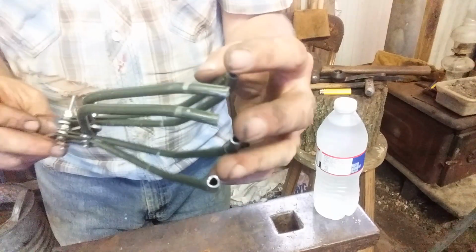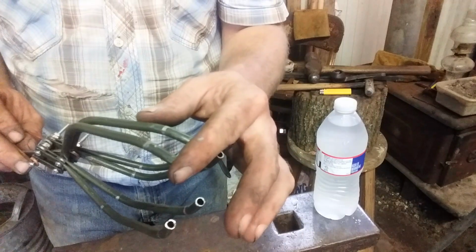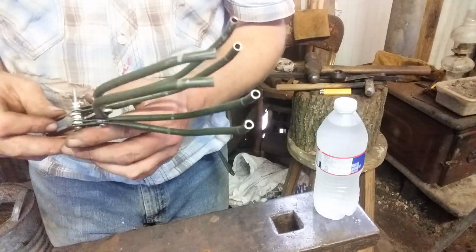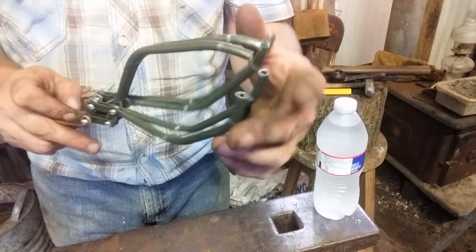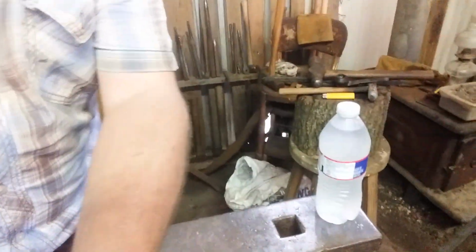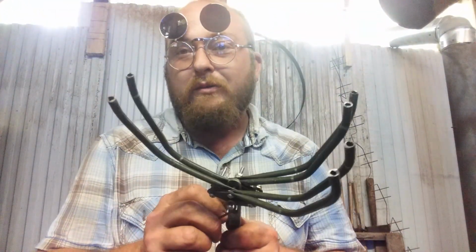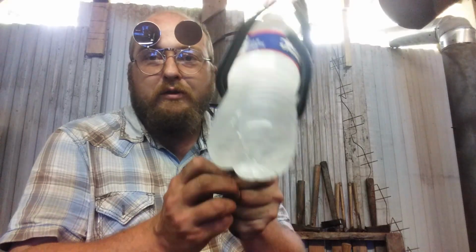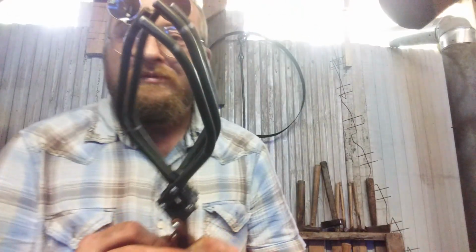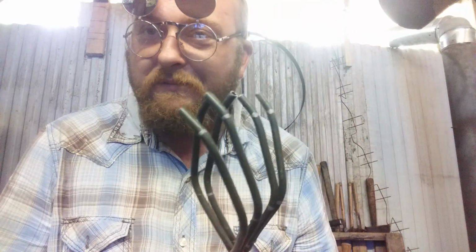And of course, I'm going to put some fingertips on here. I'm still debating whether or not to put a big mono tip across these four, and this thumb area put like a mono tip across there. I think it might be better to do that, and I'm going to do a little evening up. But anyway, we're making progress. As far as I've got to something that grabs anything so far, I actually managed to lift the bottle of water. It wasn't that great for my finger, but it did pick it up, no problem. Hopefully we can make this into something that'll be just right.